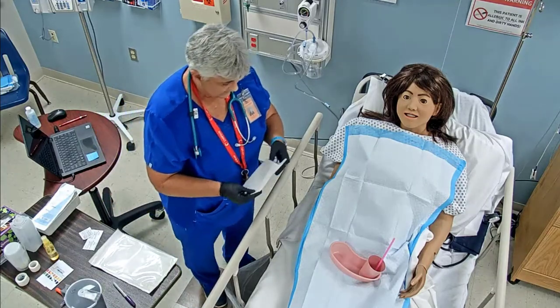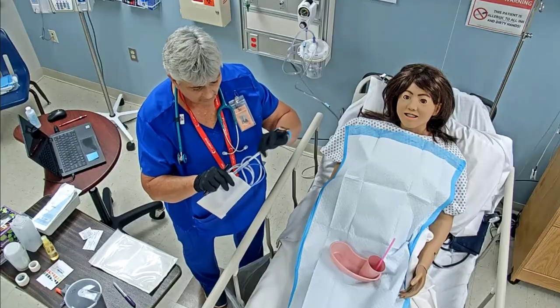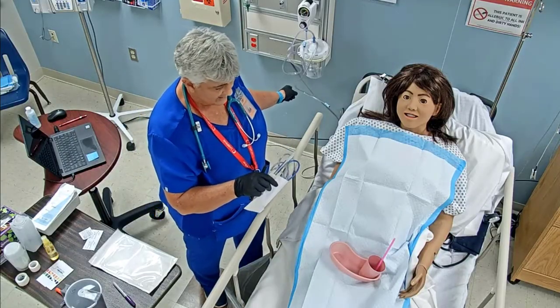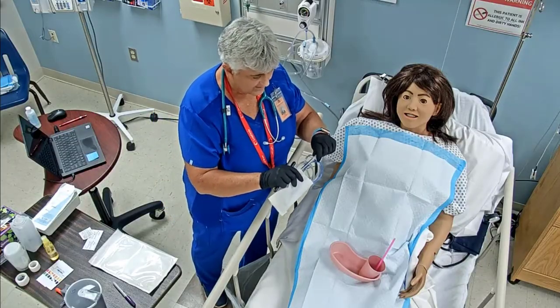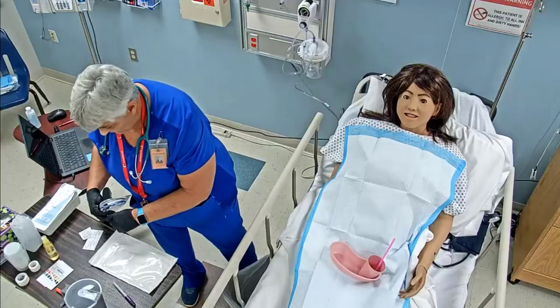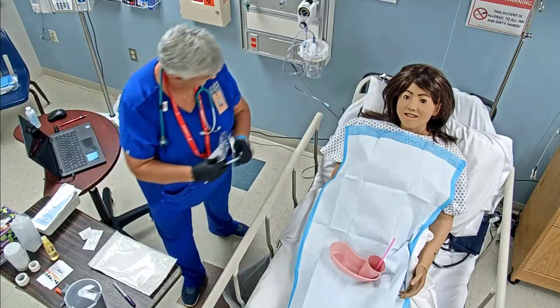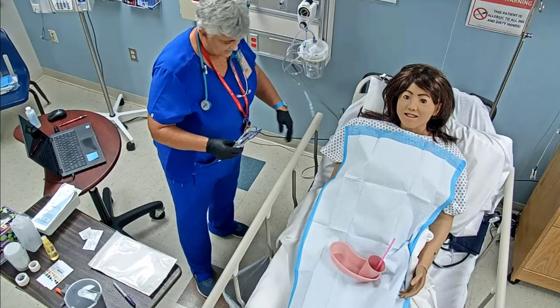Now, one of the things that we do here is you want to make sure you keep this, because this is a connection for your suctioning. So if we're not going to be using this, you need to make sure you keep it so you know where it's at in the room so you can connect it. Or you can go ahead and just use that and connect it to your suction there.